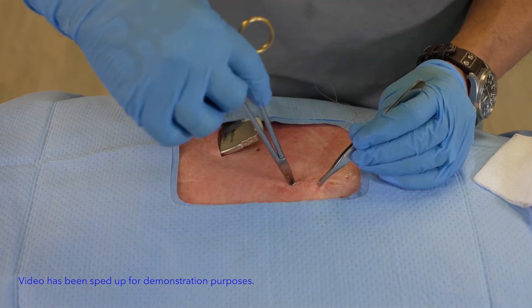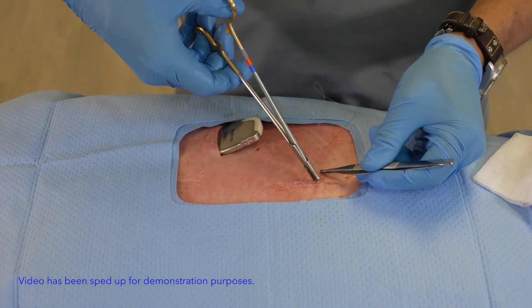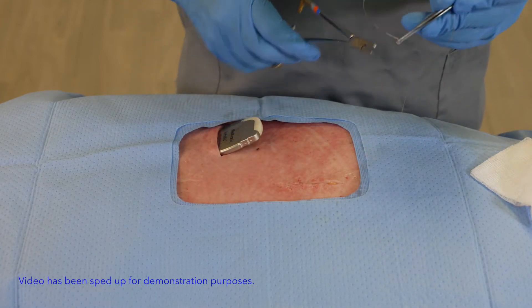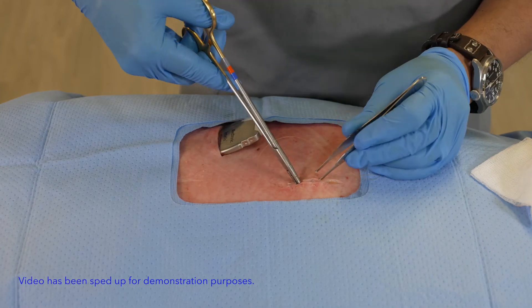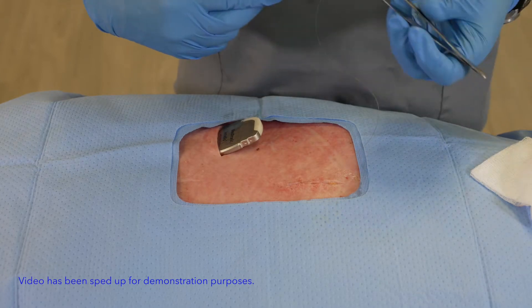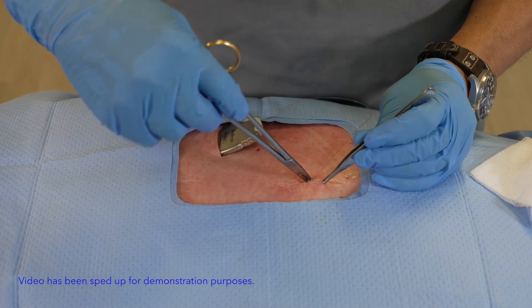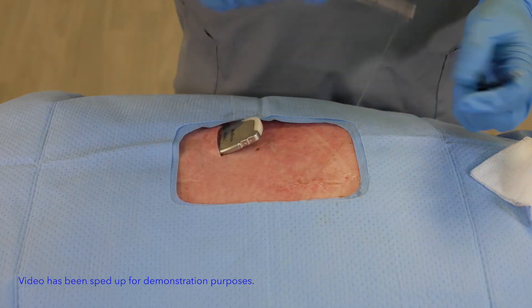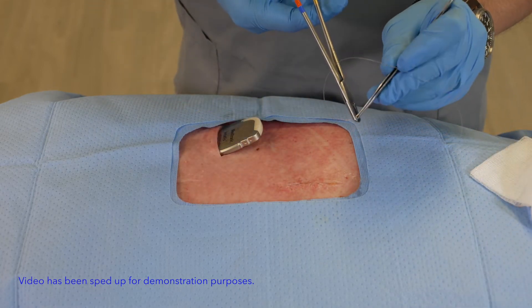As I start to bring this closure in you'll start to see that the wound itself is starting to lock in position. Some of the things we want to keep in mind is that you not only have strength but you have an aesthetically pleasing wound, which I can't say enough about — and how patients perceive their surgeons sometimes purely based on the appearance of the wound.